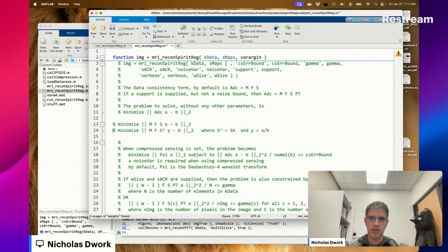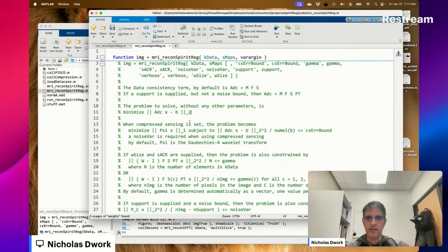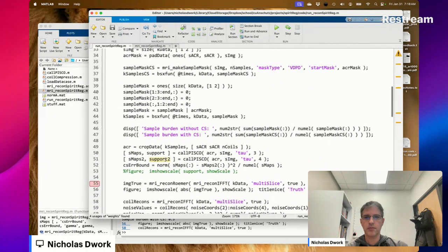There's a scaling ambiguity. And if we're going to be measuring the difference in the sensitivity maps, then maybe we should normalize them. We, of course, normalized the K-space data. Possibly PISCO's already normalizing them.